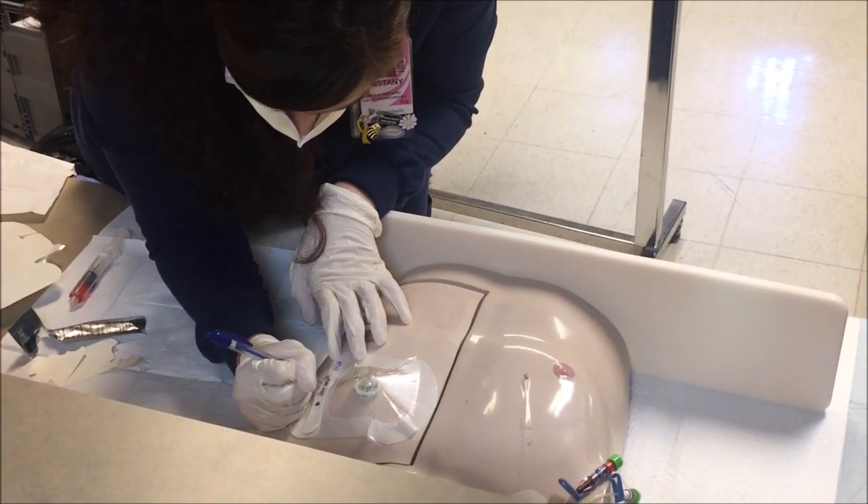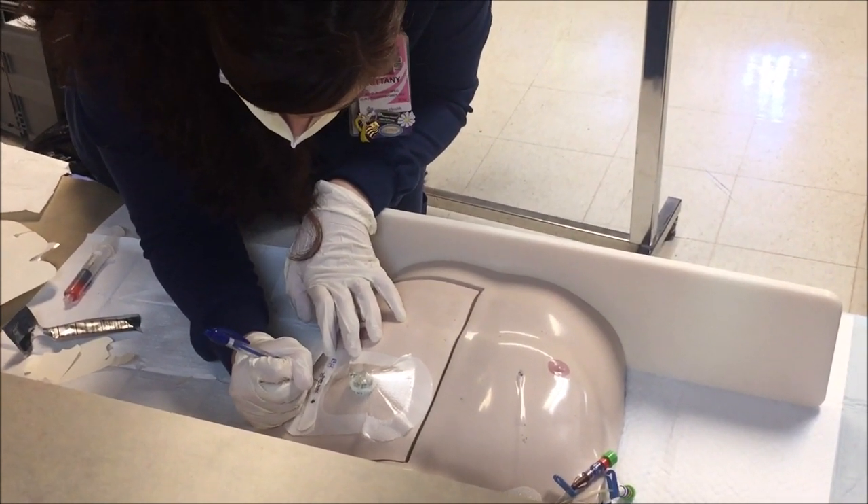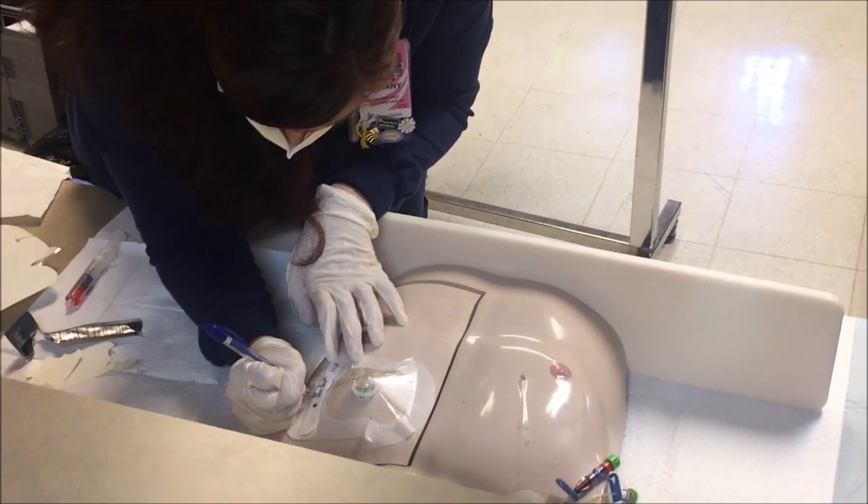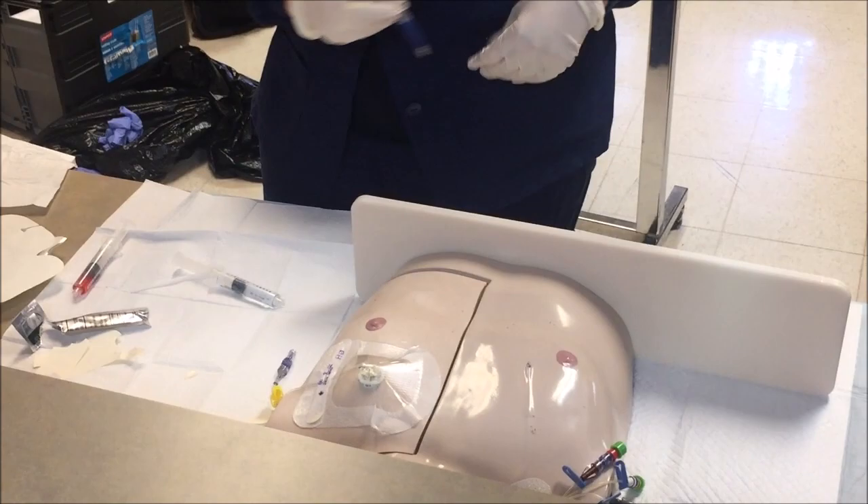Last, it is important that you label the dressing with date, time of cannulation, needle gauge, length, and your initials, as well as document in Cerner. This concludes Port Access, a step-by-step guide.